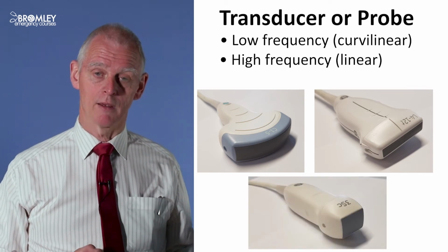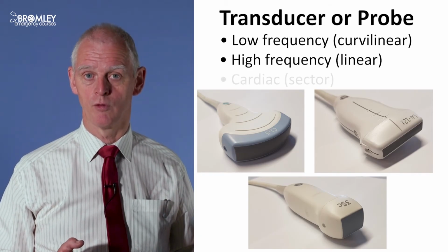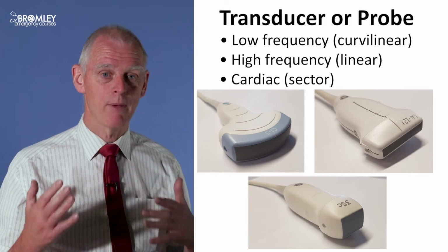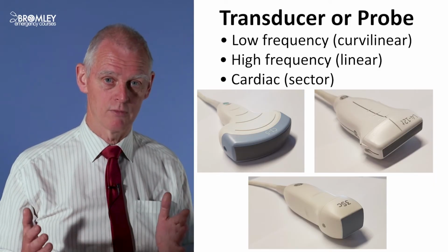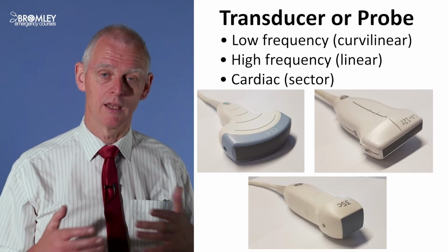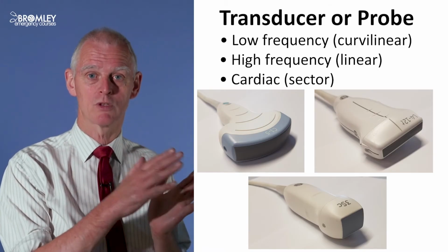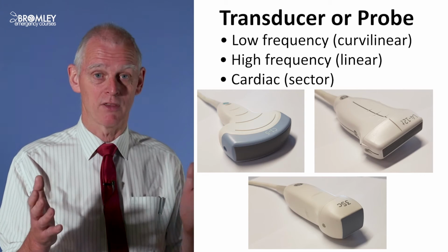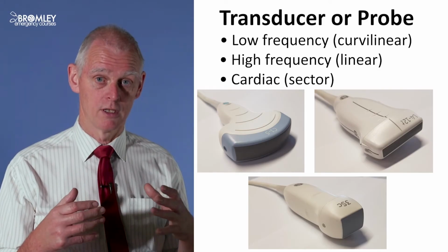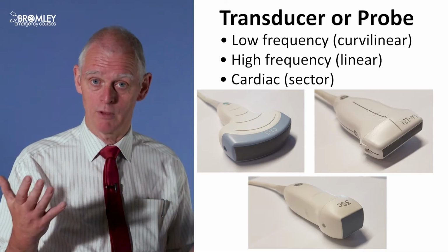The third probe here, I'm sure you'll recognize this, the third probe on the screen is the one that we use for the heart, the cardiac probe. So let me just say a little bit about that because I think the history is relevant to this. When ultrasound started to be used clinically, so it had come out of sonar and so on from ships, when it started to be used clinically, which is really about the late 70s, I think, there was a great deal of interest in looking at the heart.